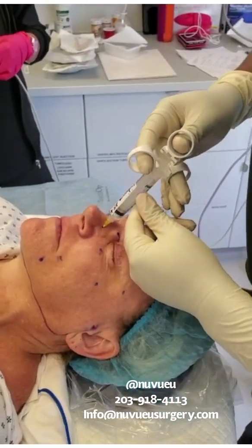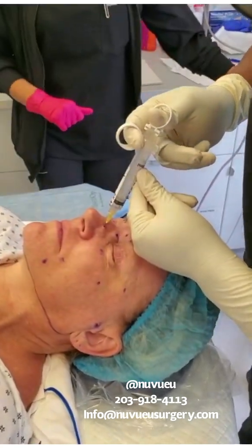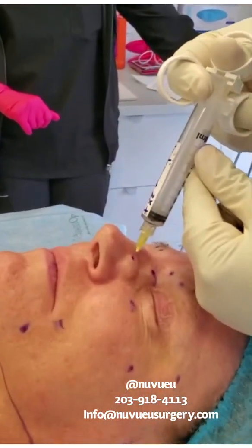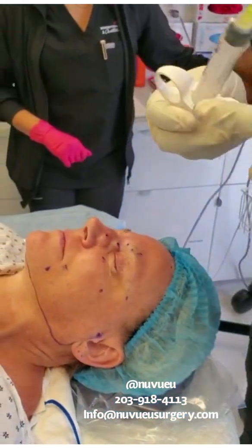All the way down. Aspirate. And you're going to block. We're done with the block.